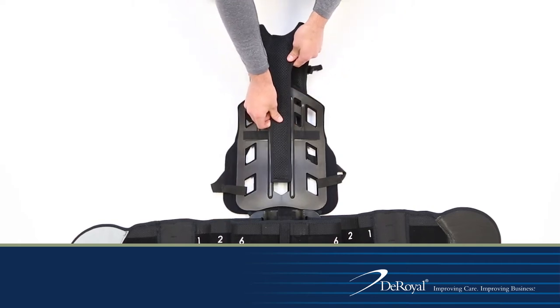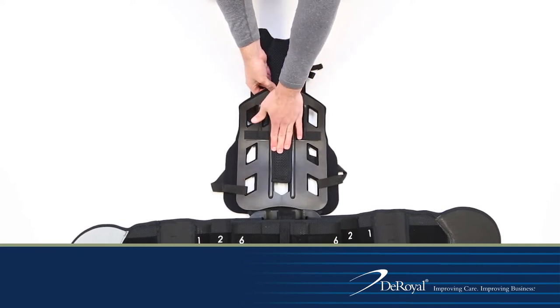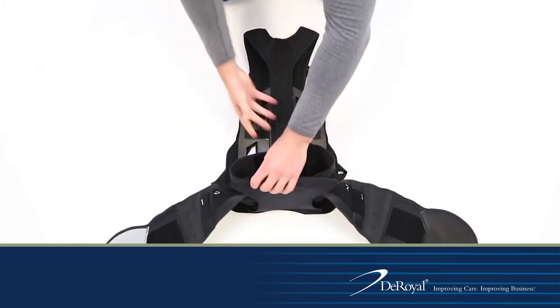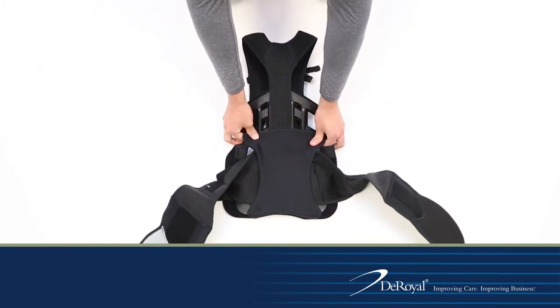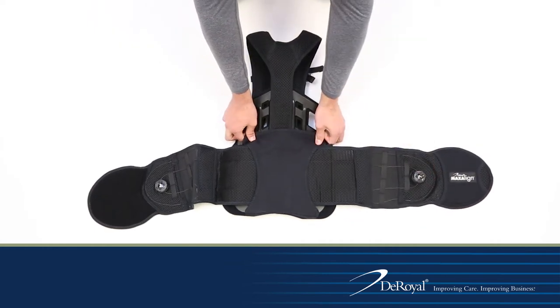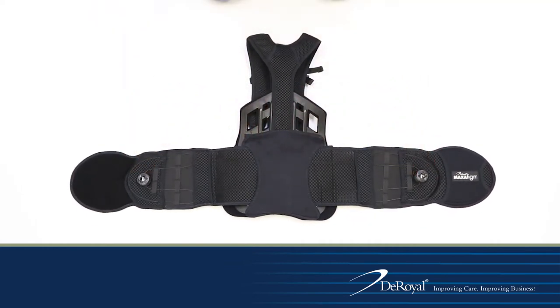Position the DLE so that the yoke of the shoulder straps aligns with the C7 of the patient. Once height adjustment is complete, press firmly along the back of the DLE to anchor securely. Fold the back panel and belt over, reattach the back flap hook closures at the top of the back panel and press down firmly on the securement strip.